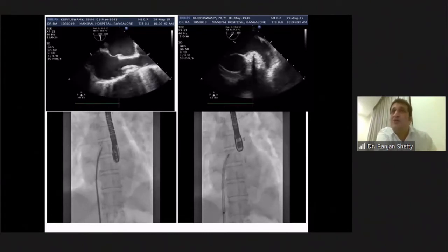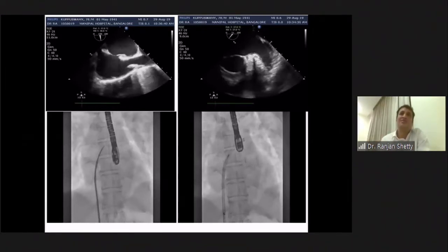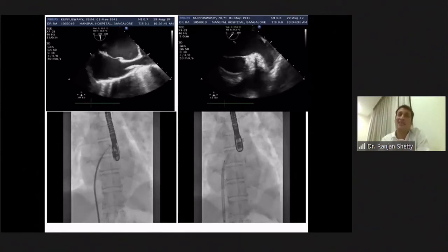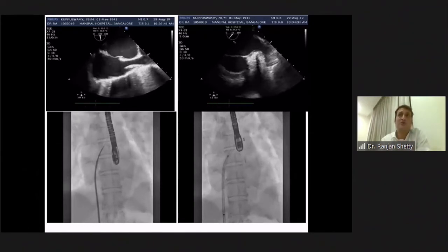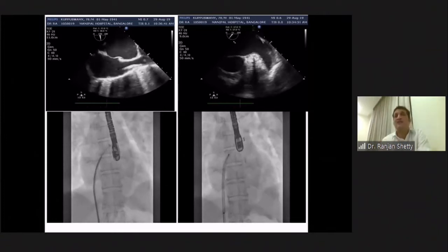If it is not above 10, this is the time to hydrate, because the LA is a dynamic, pressure-sensitive structure, and the measurement could be altered slightly if you measure it when it is actually underfilled.